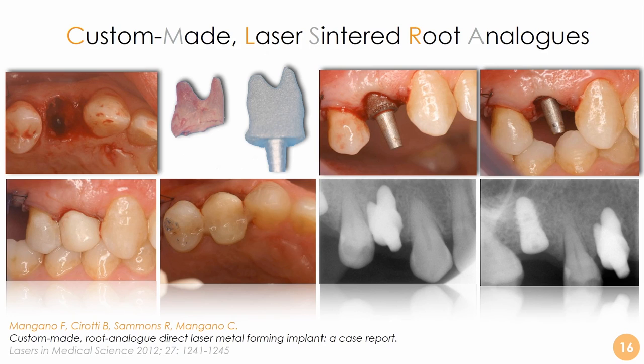And these are cases a little bit more tricky, because not only monoradicular teeth can be done with this technique, also the first premolar, for example, in the maxilla. Look at how funny it is, the radiograph with the tooth that has 2 roots.